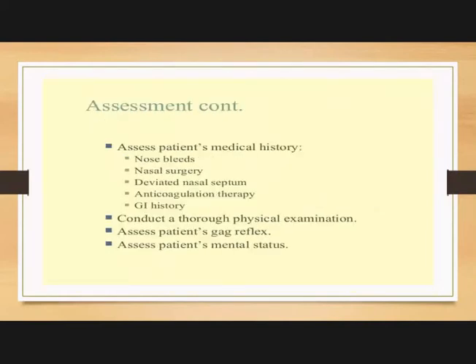Firstly, assess the nasal patency. First, we will check the nasal nostril. How to check? Press your hand on the other nostril and press down, and ask the patient to take a deep breath.